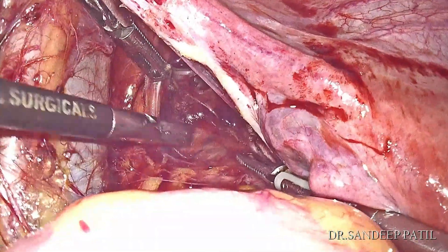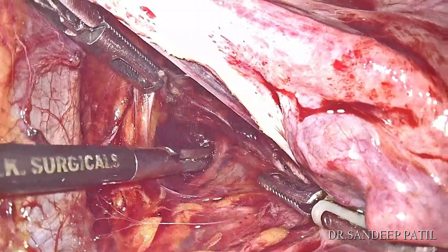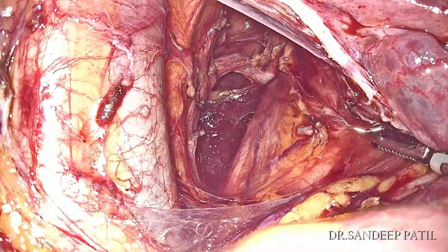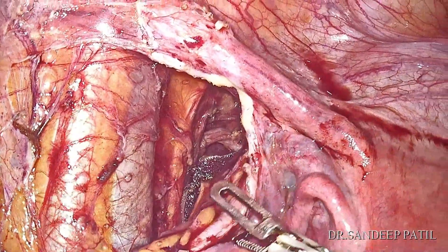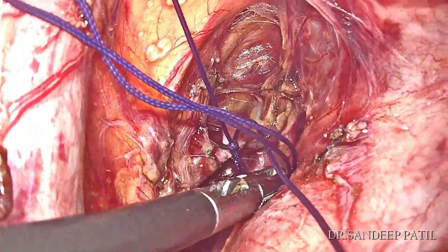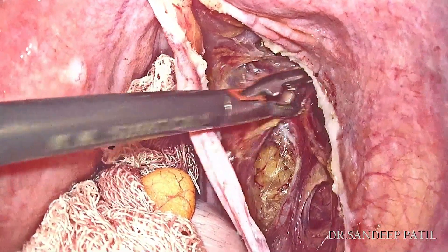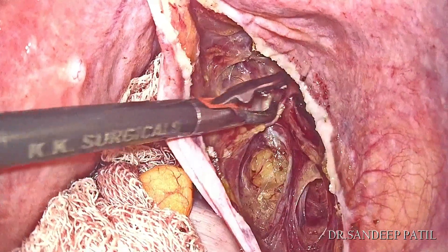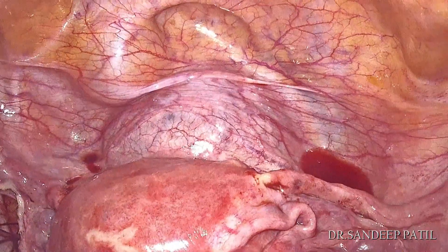The mean arterial pressure in the uterine vasculature is reduced and it helps in reducing blood loss. However, according to us this step is not completely mandatory. With good surgical skills, maintaining proper planes and judicious use of diluted vasopressin are more than enough to reduce intraoperative bleeding.